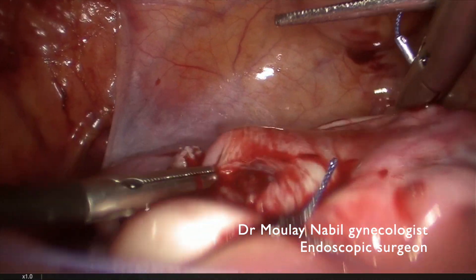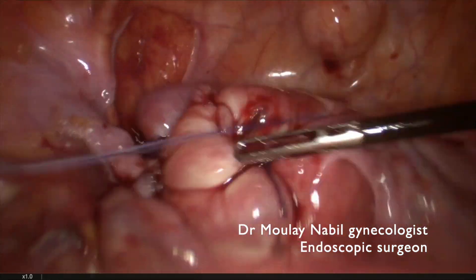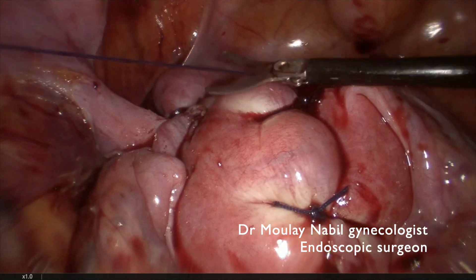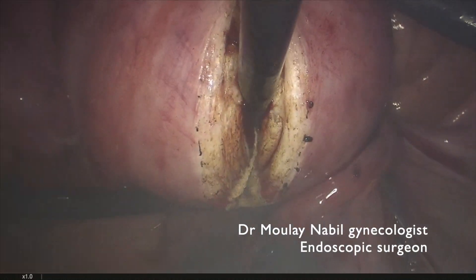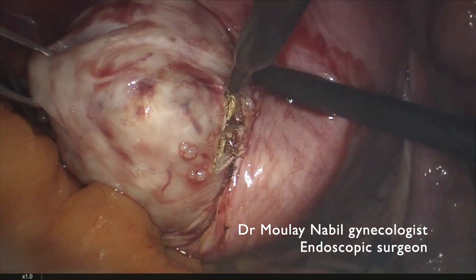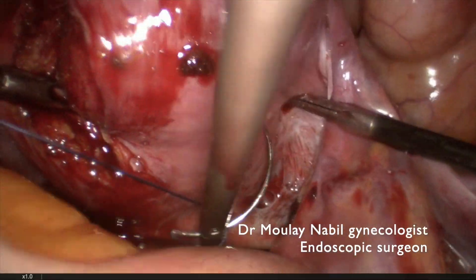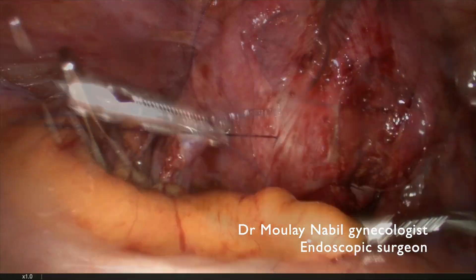We continue the downward part of the hysterotomy closure. We perform a longitudinal hysterotomy each time, which facilitates further closure. The hysterotomy is well closed, there is no bleeding, and we can now remove the third myoma — a 7 cm type 2-5 myoma. Same technique: longitudinal hysterotomy and myoma extraction, using the dissecting plane as much as possible. The myometrium is quite simple to dissect and bloodless.